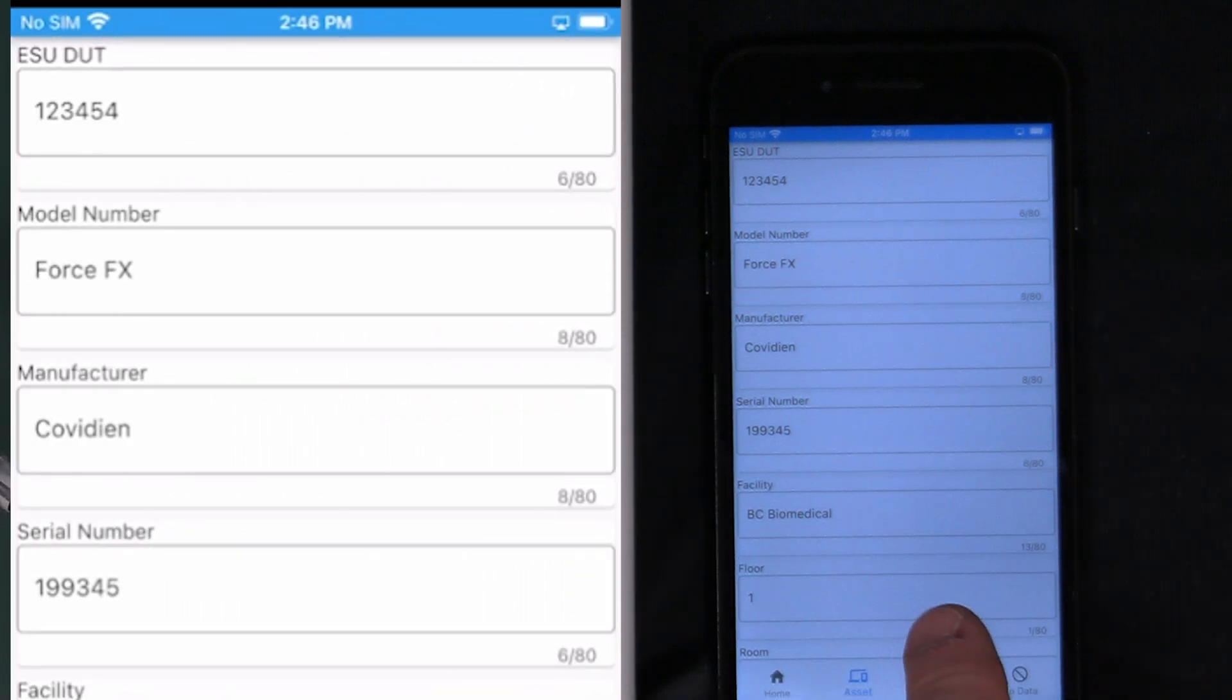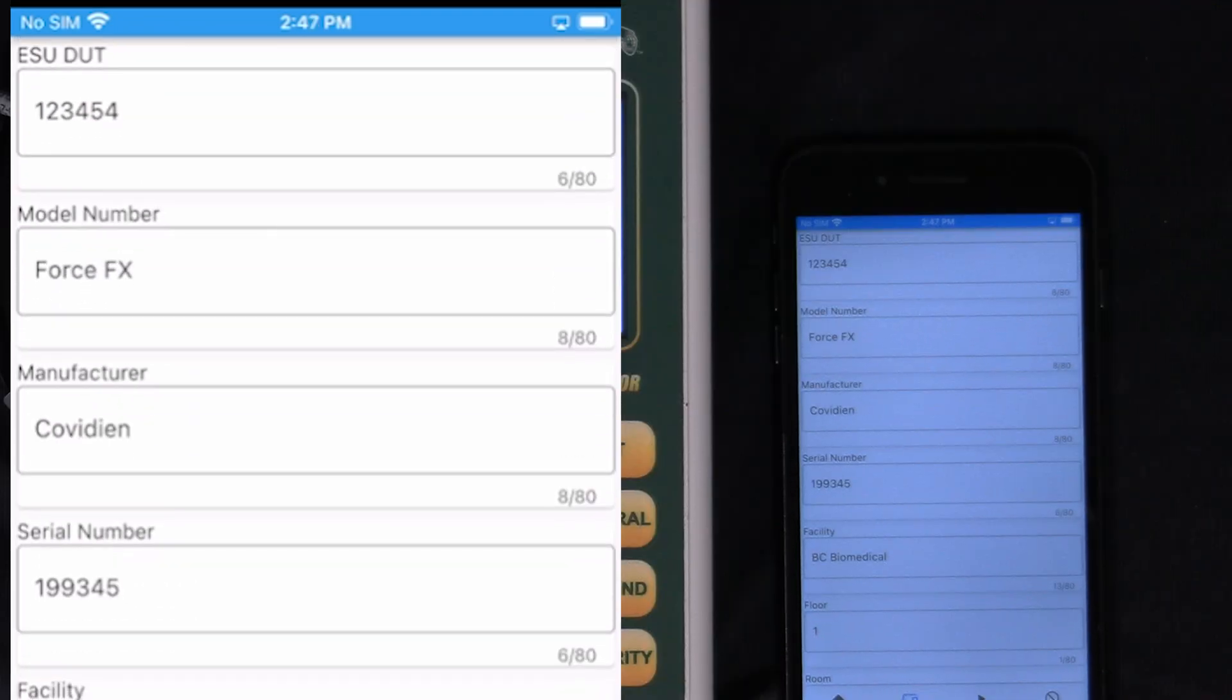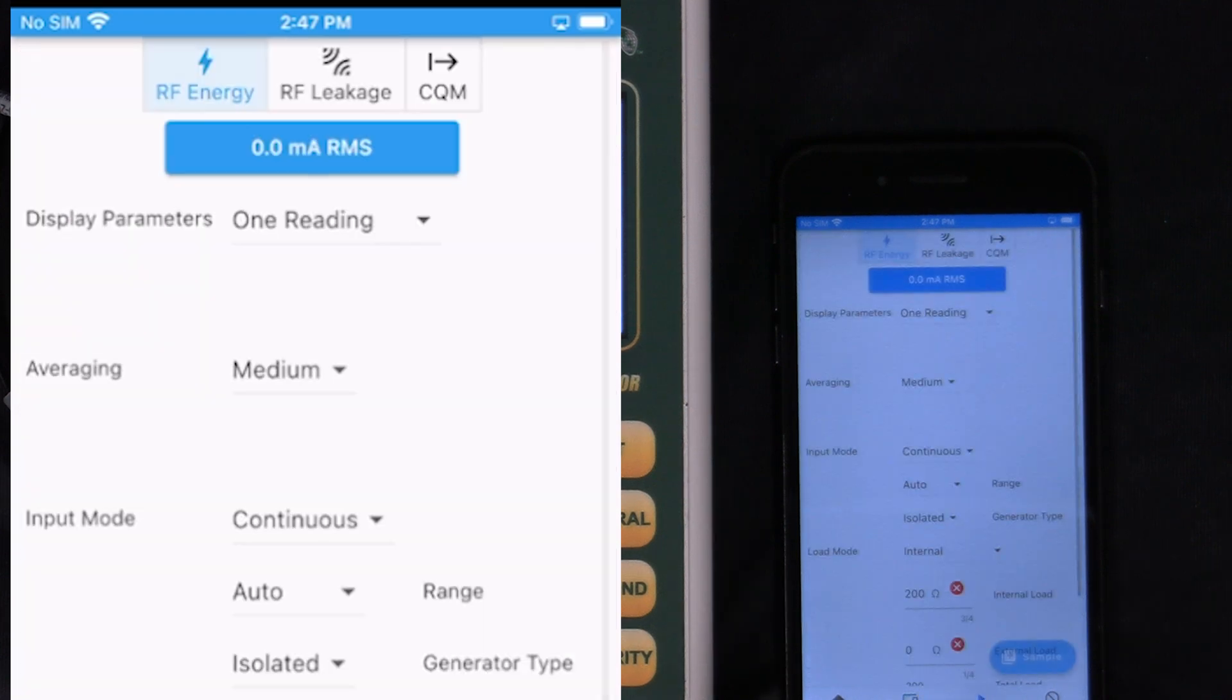This confirms on the screen that I have the correct asset selected. If I didn't I could go back and select the correct asset. There's no data yet so I'm going to go straight to test and now I'm presented with what options I want to test.